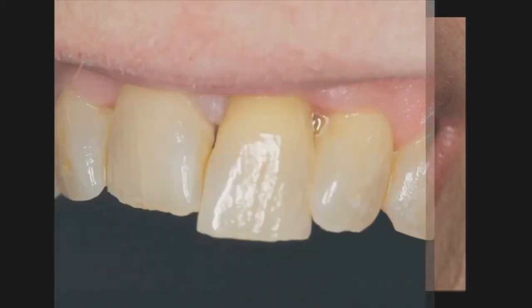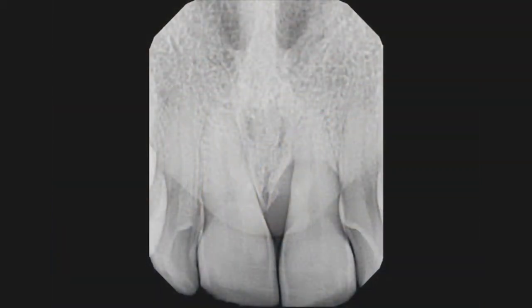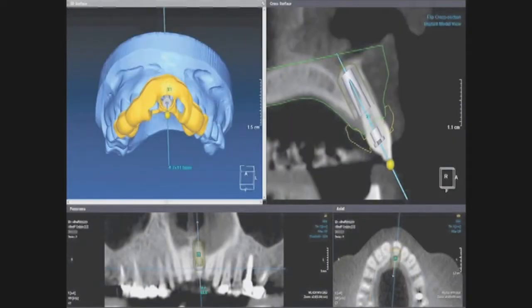Amazing. Our second case was a person who had a periodontally involved maxillary left central incisor. The tooth had supererupted, was mobile, and was obviously an aesthetic concern for our patient. Figure 2 demonstrates the digital radiograph of the periodontally involved maxillary left central incisor, tooth number 9. Again, a CT scan was done, and an implant was virtually placed in the maxillary left central incisor area.